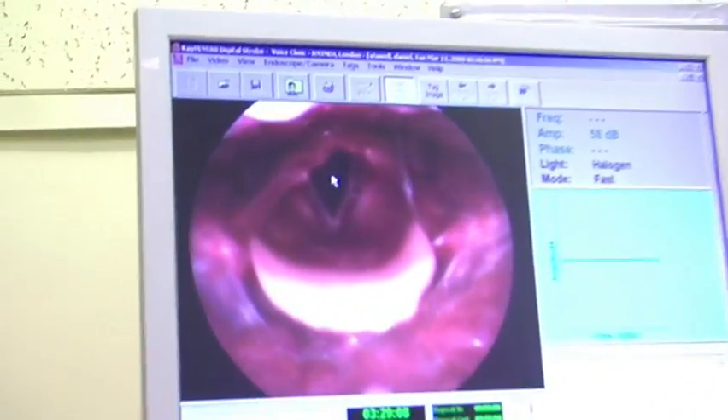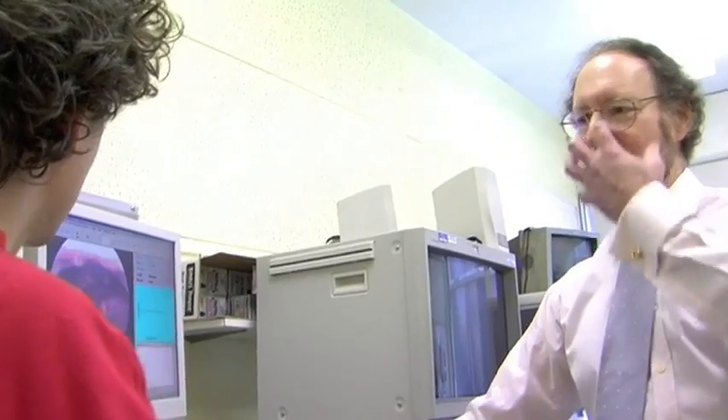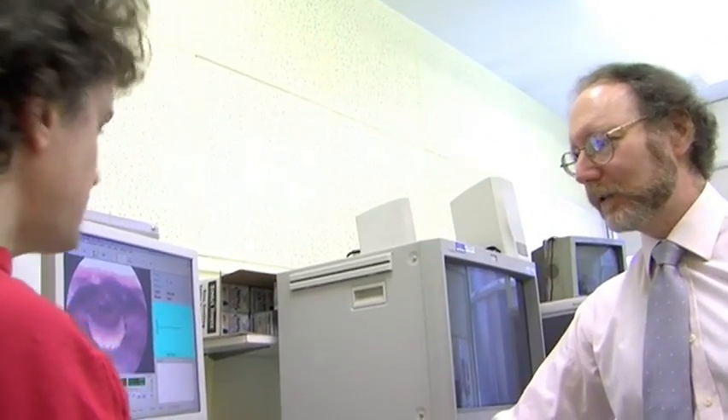So you were probably taking a quick breath in, and then when you did the vrum vrum sound, you probably had your vocal folds closed and constricted, and were pulling your whole tongue and back of the pharynx down to create that sound. You can see here that the base of the tongue is working terribly, terribly hard most of the time, quite consistently - you're pulling it right back.